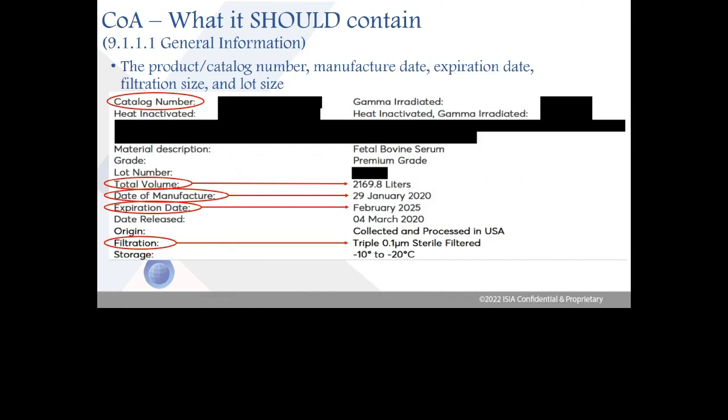One, you, the end user or purchaser, are aware of the quantity that may be available for purchase. And two, having the total volume processed reported on a C of A can aid in reducing counterfeiting of fetal bovine serum.